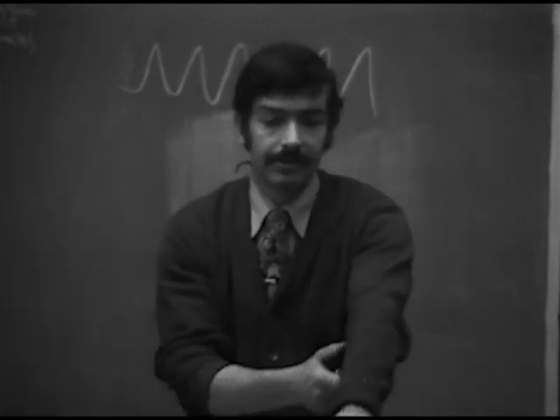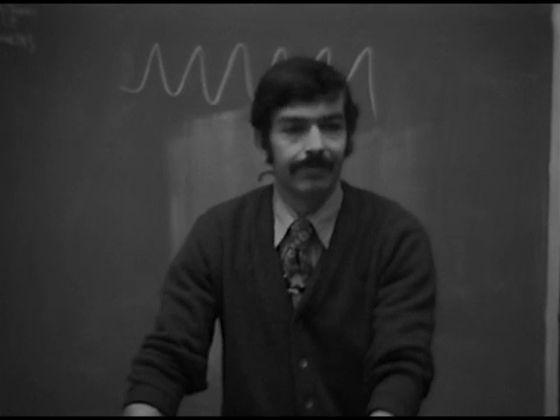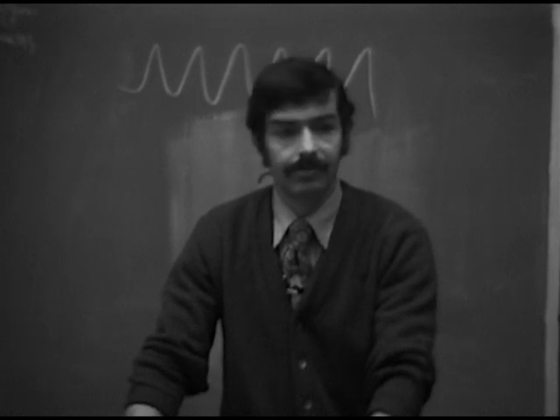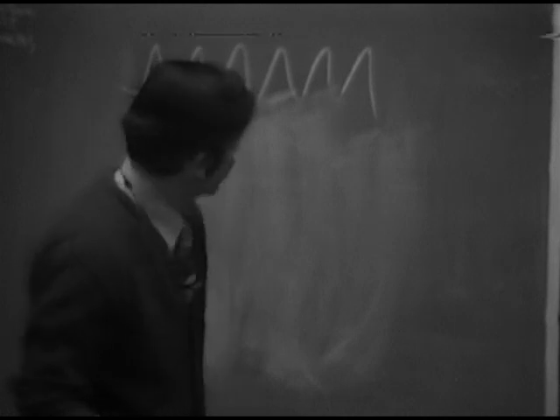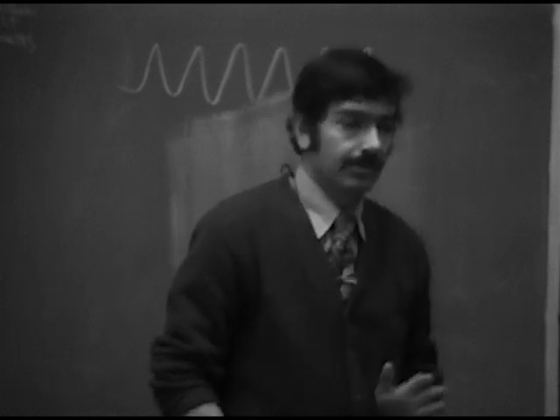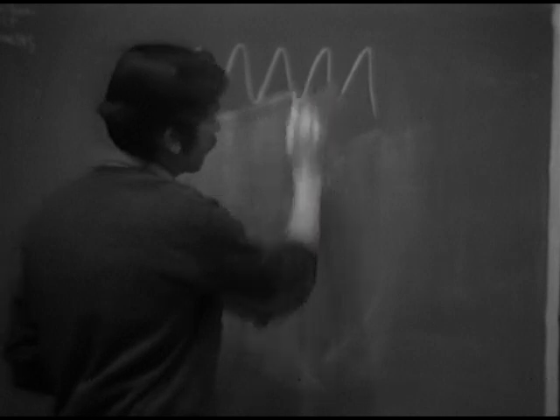Now, certainly, if the patient's in terrible shape, has no blood pressure, you don't want to waste a lot of time doing different things to differentiate the two, because he has to be treated immediately. So, of course, you would shock him right away if the patient was doing very poorly. Okay, the question comes up when the patient is doing reasonably well. Then it becomes important to differentiate these two.